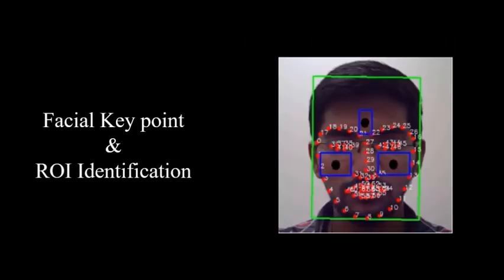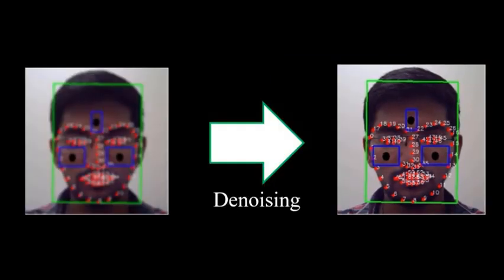Following which, the detected face will be tracked using continuously adaptive mean shift function, thus supporting face orientation and enabling lossless face detection for every frame. On completion of skin segmentation, facial key points get positioned based off Kazemi and Sullivan's ensemble of regression trees method, which estimate the landmarks of the face using a sparse subset of pixel intensities, helping achieve high quality predictions. The regions of interest are located in skin regions and, like the key points, are referenced to the face detector bounding box.